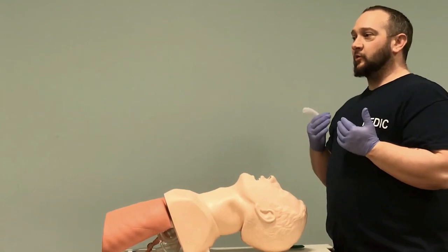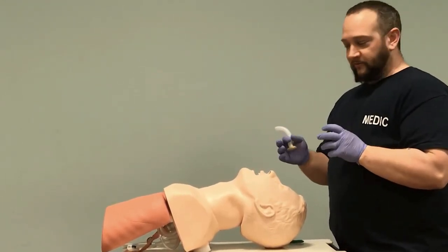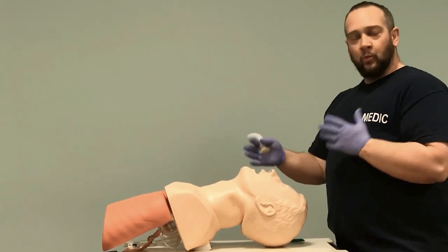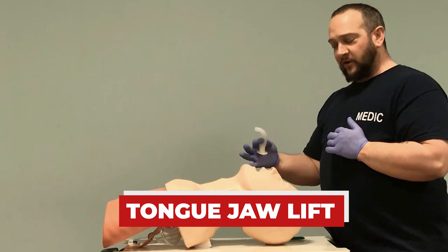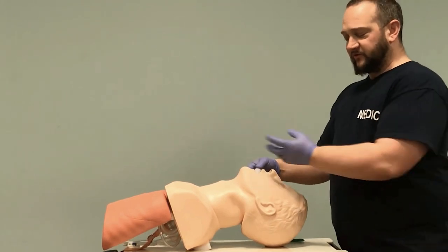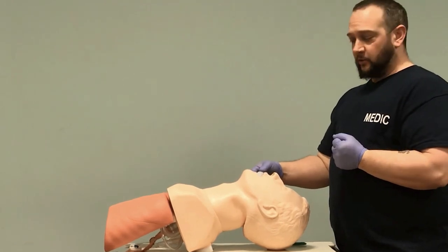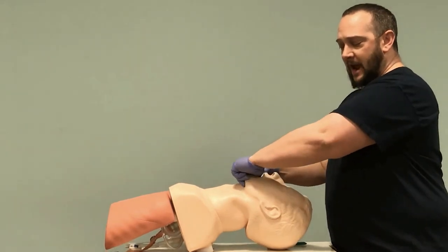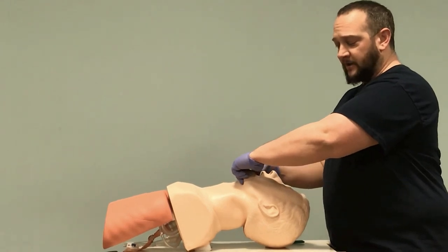We teach the tongue-jaw lift technique. Once the OPA is sized, you can use it almost as a bite block — because if the patient is responsive, they could clamp down and break your finger. With the bite block in place, grip the tongue and jaw together, giving you a good hold to come in with the device.